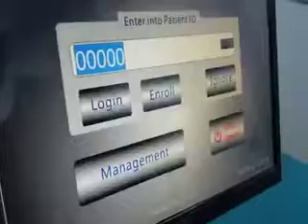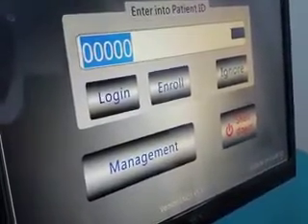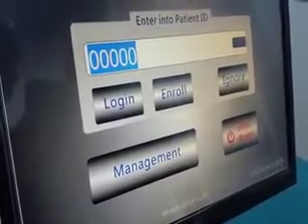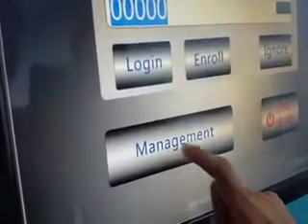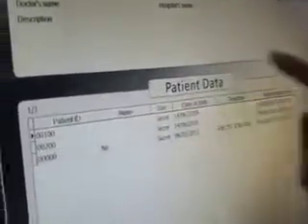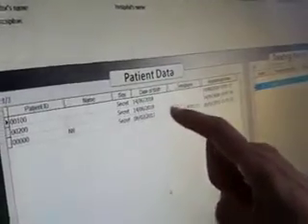The doctor may want to review the data for this patient. You can turn back to the ECP MC3 system interface and press management to enter the data management system. In this system, you will find all the patients who have been treated with the ECP machine, and in this section, you will find all the treatment data for each patient.